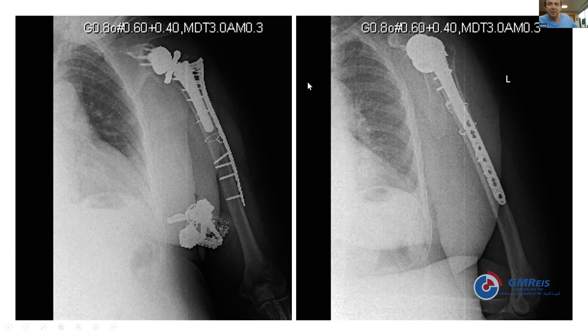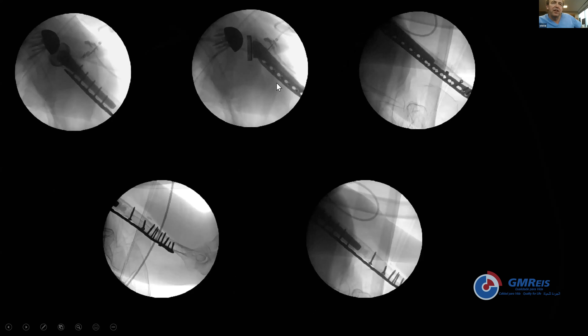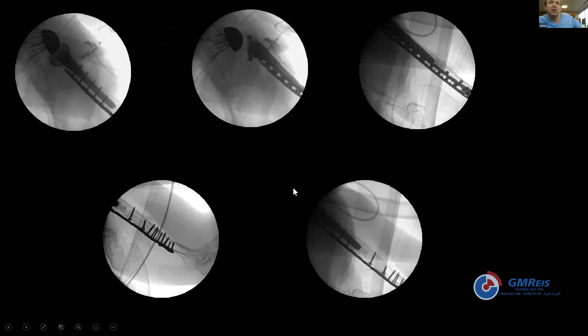These cases illustrate using plates made for different parts of the body in creative ways — in the end they're just plates, and with enough thought, other uses can be found for them. In another x-ray, absolute stability was pursued with lag screw fixation and a long plate, clearly not going for bridge plating but rather absolute stability.